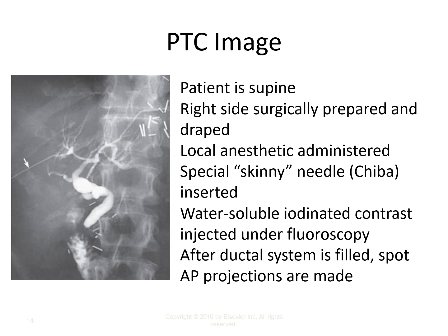So here's our PTC image. You can see the arrow indicates the needle gaining access to, it looks like, the right hepatic duct. And then you can see the left hepatic duct is lit up. The cystic duct is lit up. And a very tortuous common bile duct is lit up. And at the very bottom of the image, contrast is passing into the duodenum of the small bowel.